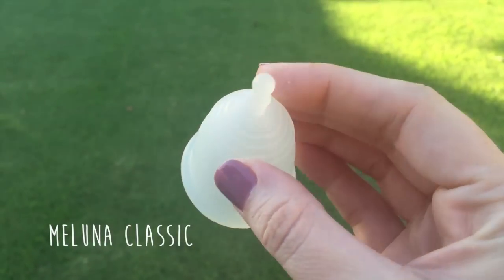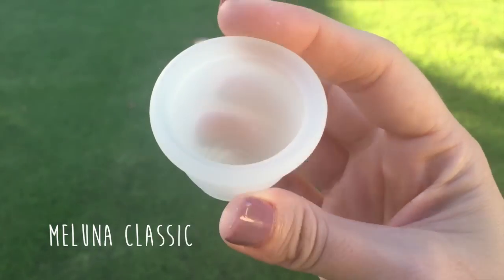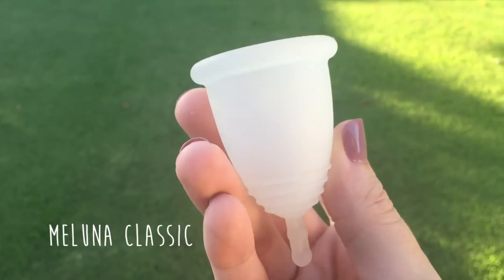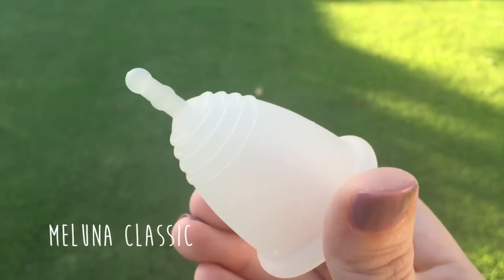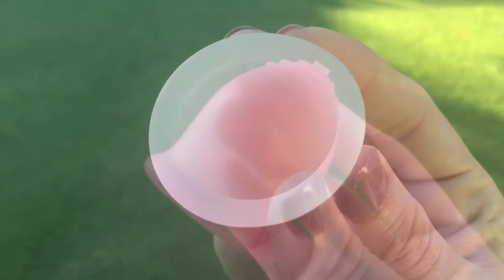First up we have the Maluna Classic size large, made in Germany from TPE, which is Thermoplastic Elastomer. I have this in the color clear. It has a diameter of 44 millimeters, a length of 50 millimeters, and a capacity of 24 milliliters.